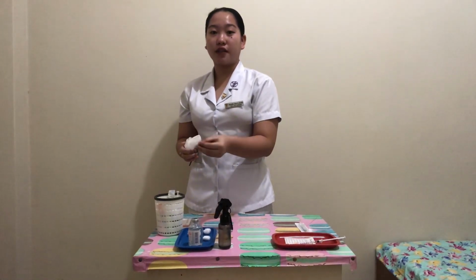So dispose the broken piece of the head and neck to the sharps container, as well as your gauze.